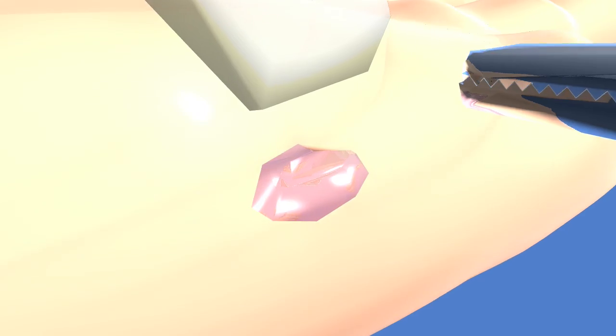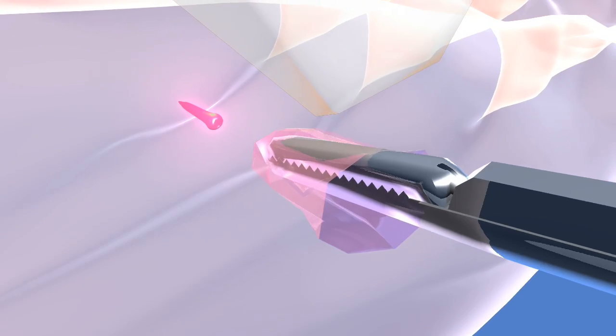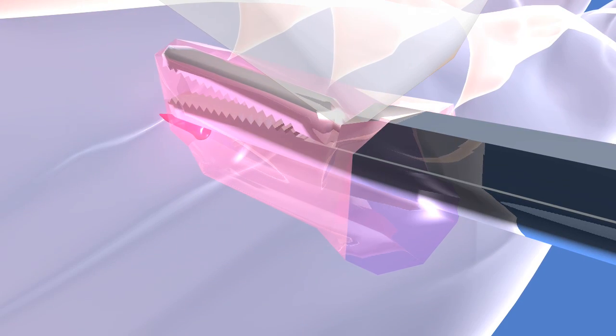To further illustrate the important points, this minimally invasive technique is performed through incisions as small as 4 to 5 millimeters, particularly with the Hartmann alligator forceps seen in this animation.